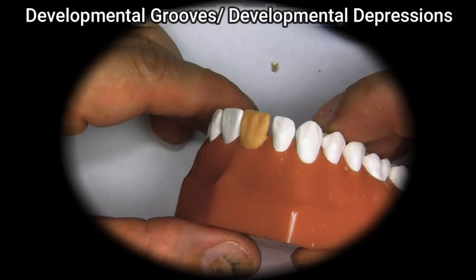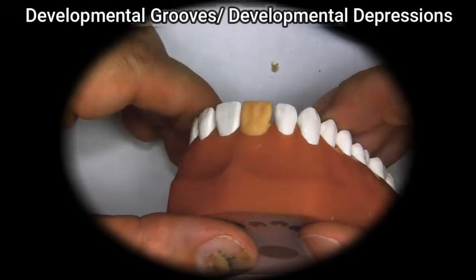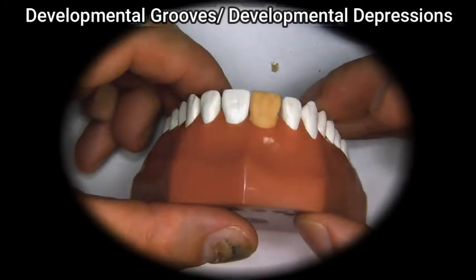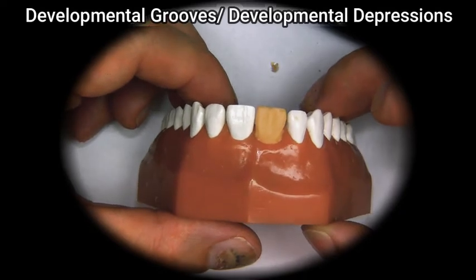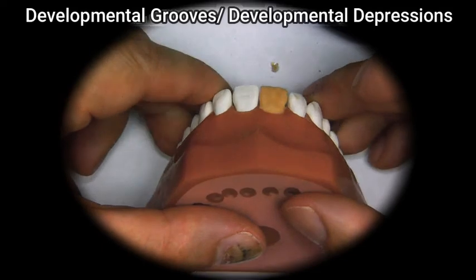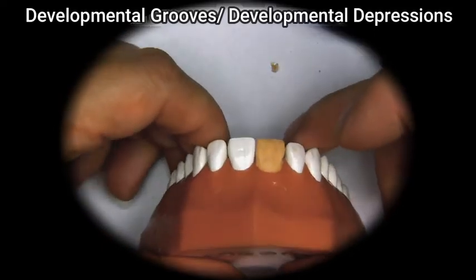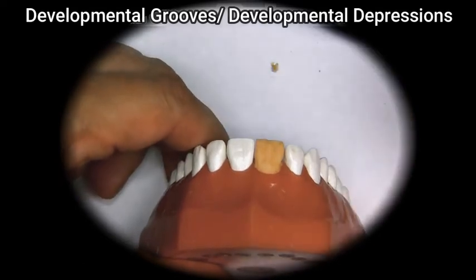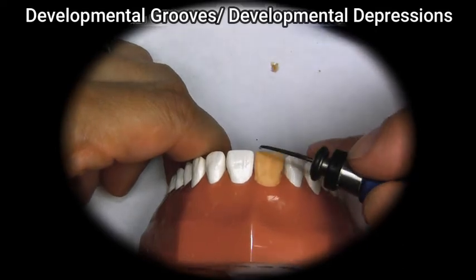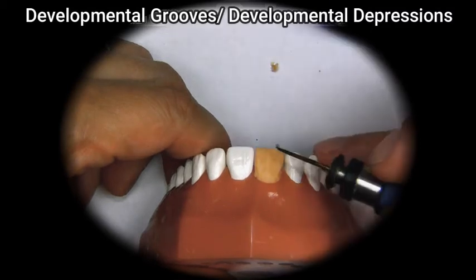You have little shadows that get created as we look at it. So now we have a general shape of the tooth, and now we have to double check to see that the incisal edge is similar to the incisal edge on the adjacent tooth, which is tooth number 9, or left central incisor.